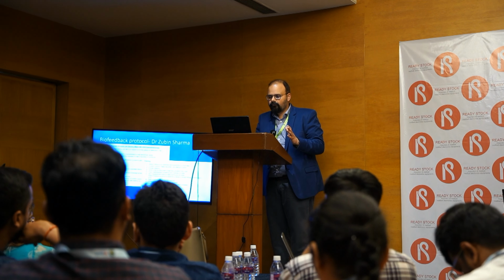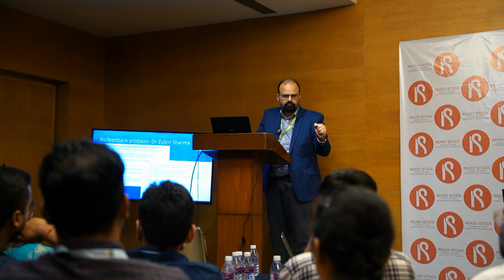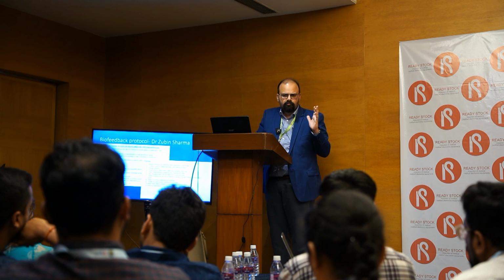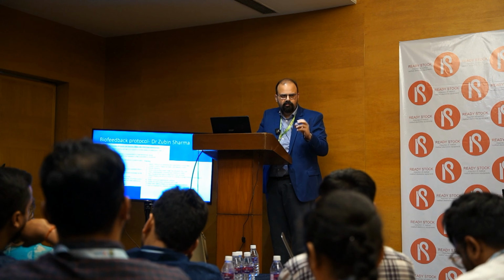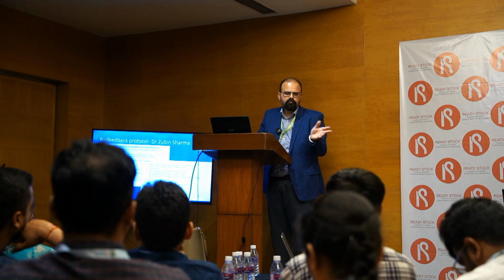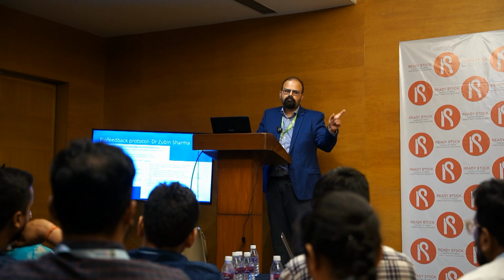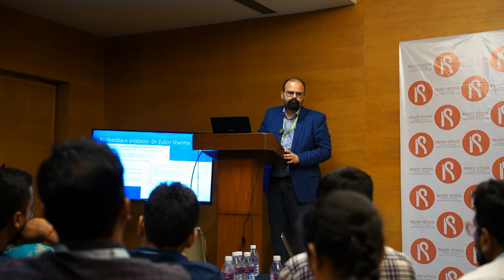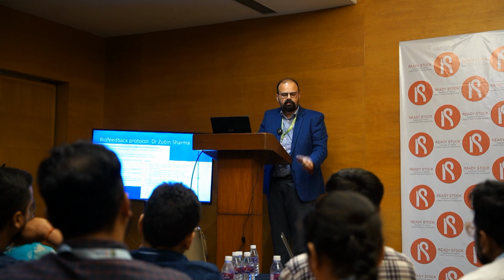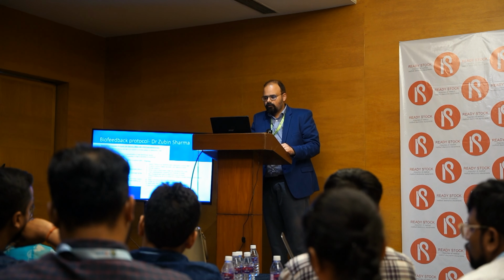I'll show you the video. So you focus on the anal sphincter first. You ask them to squeeze, and then to relax as much as possible, and do it 30 times, 40 times, whatever is possible during your session, and ask them to do that again and again at home whenever they get time. Even in the office, sitting on the chair, not doing anything, squeeze, relax, good enough, whatever works.